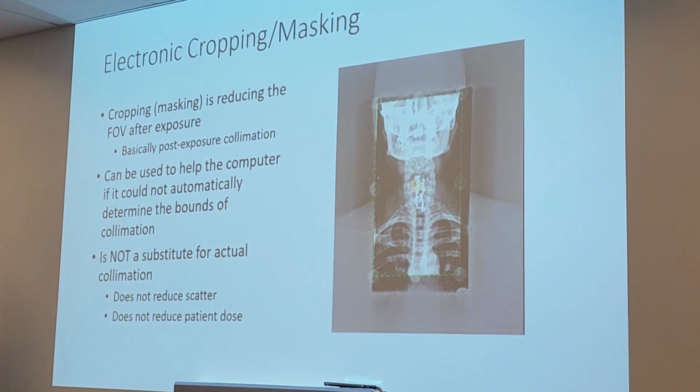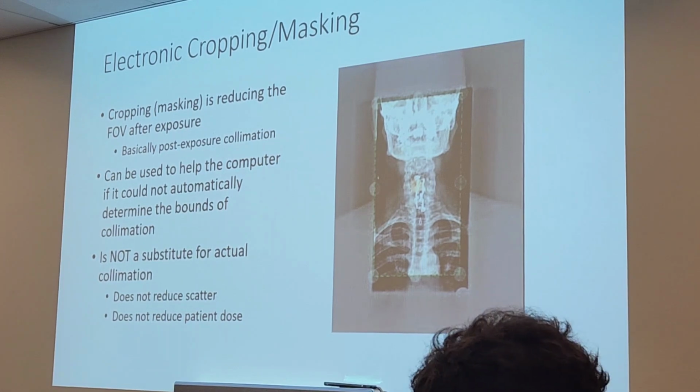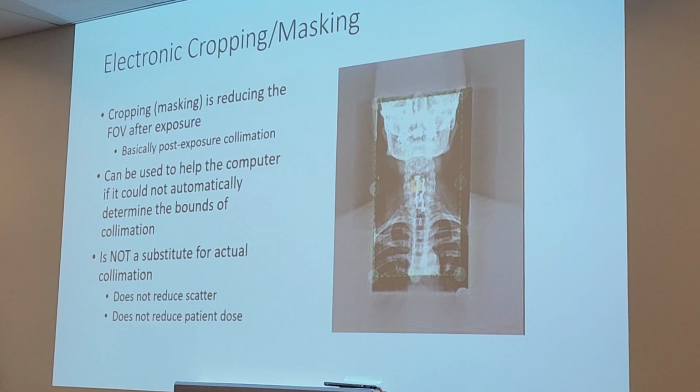When that image gets to the radiologist's monitor, they have a completely different type of computer monitor with completely different standards. So the way the image looks on your screen is not how it looks on their screen. You changed it so it looks good on your screen, but now it may look bad on theirs. And they no longer have the option of getting back to the old information because you post-processed. So rather than trying to make the image look good for the radiologist, send it as is and let the radiologist make it look good for themselves. Does that make sense? It doesn't matter what it looks like on your screen unless it's obviously bad, in which case you might be better off just reshooting it. But just send it across to the radiologist, let them handle the post-processing so that they can make it look good on their own screens.